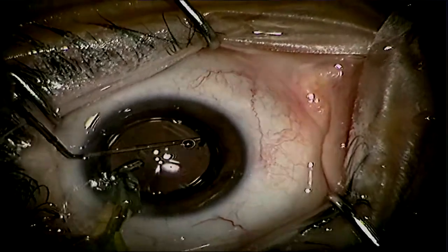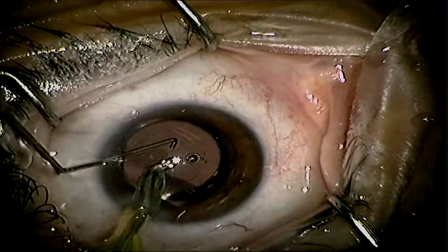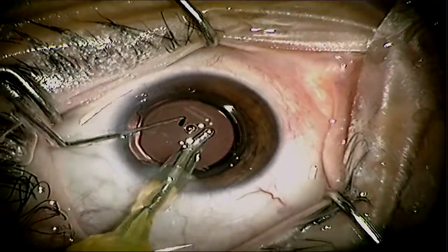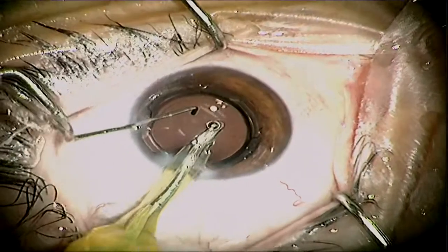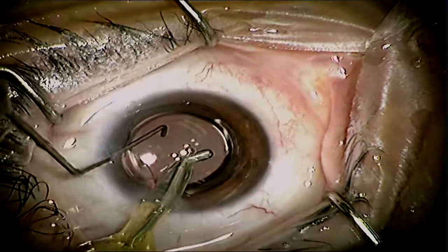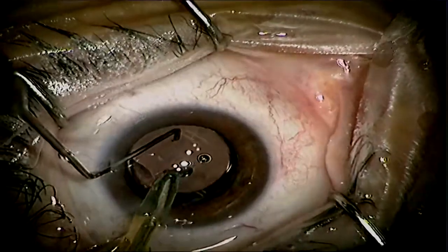Now that the lens is inside the capsular bag, we can easily use bimanual rotation with the IA handpiece as well as the secondary instrument. In this case I'm using a chopper to rotate the lens in a clockwise fashion quite easily.